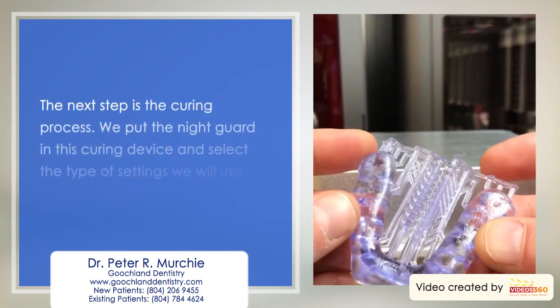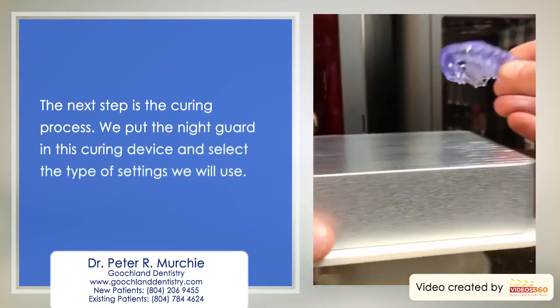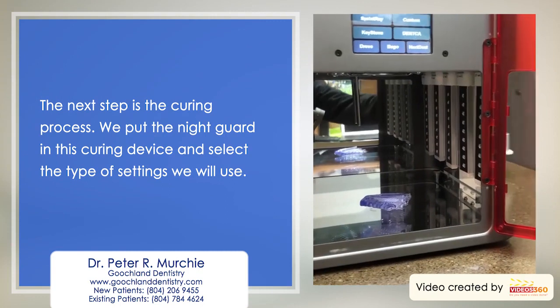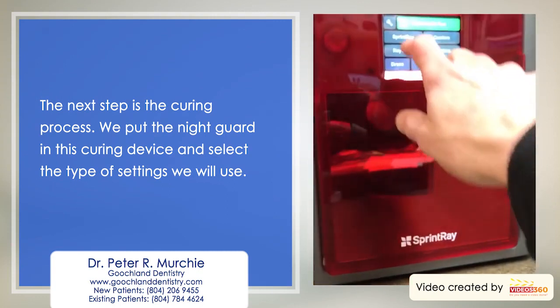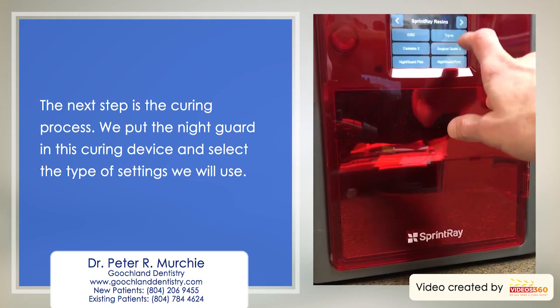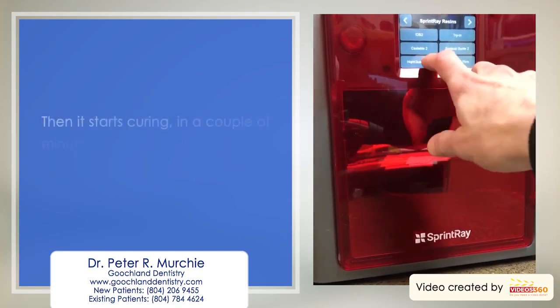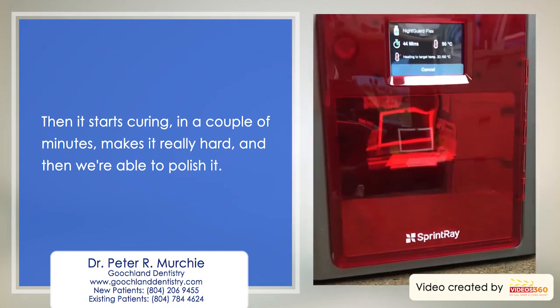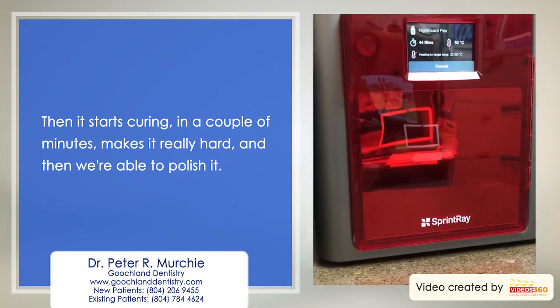And the next step in the curing process, we put the night guard in this light curing device, and we'll select the type of tray and material that we used. And then it's going to start curing in just a couple minutes. It makes it really hard, and then we're able to polish it.